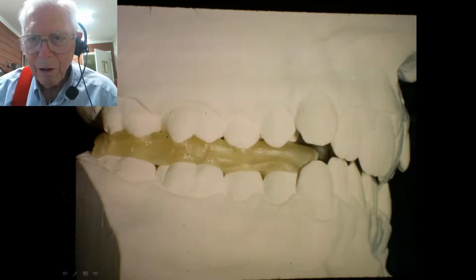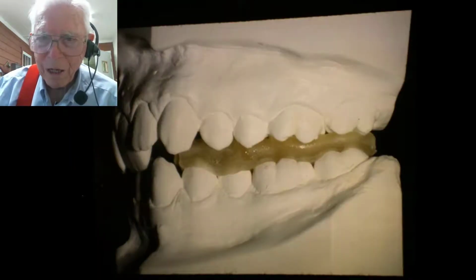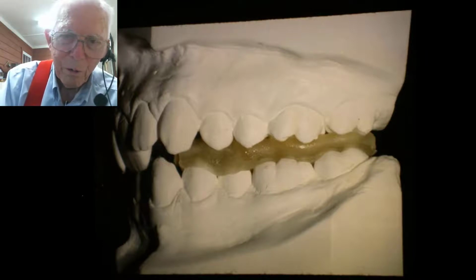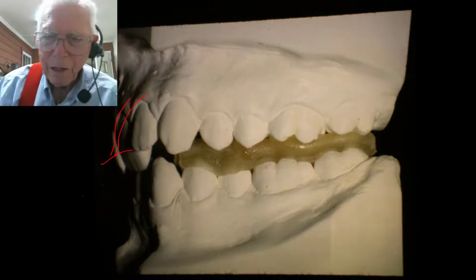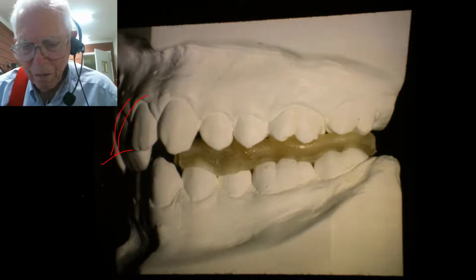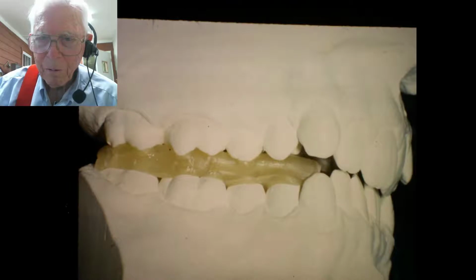Excuse me here, and then erase that. And now let's go to the other side. It's the same thing over here. But anyway, we're going to bond some blocks back here, and we're going to open this bite like that. And then we take those off. We have to get some room for them. But I'm just showing you how to make them.